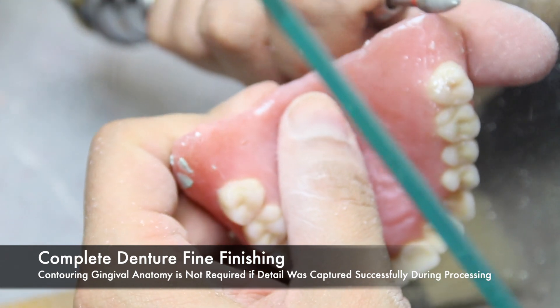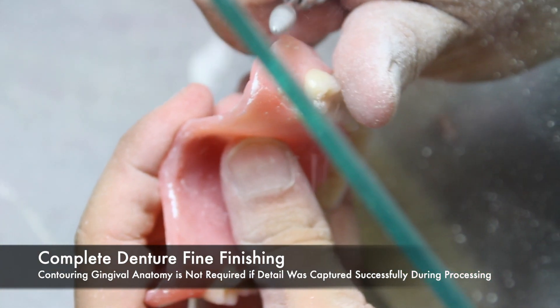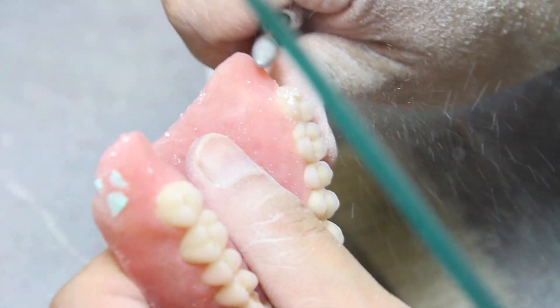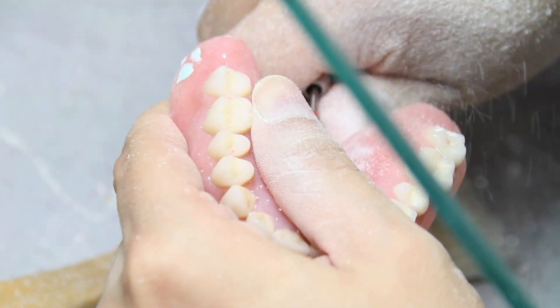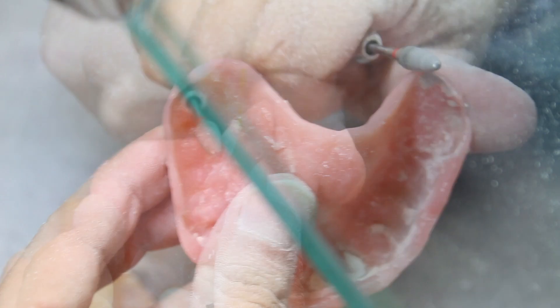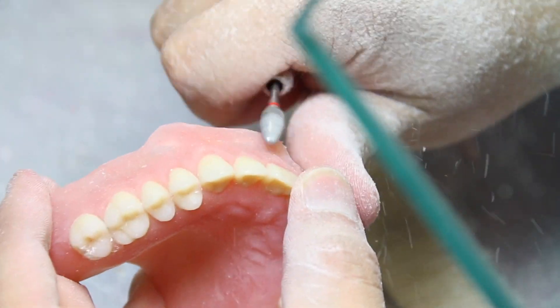There are some dental technicians that prefer to contour the gingival anatomy when the denture is already in acrylic. However, I believe that a majority of denture technicians prefer to contour the gingival anatomy in wax. If the denture has been contoured properly in wax, then contouring in the acrylic will be minimal. Be diligent in smoothing all necessary surfaces. If all the surfaces are trimmed and smoothed properly, then the next step of pumicing and polishing will be that much easier.